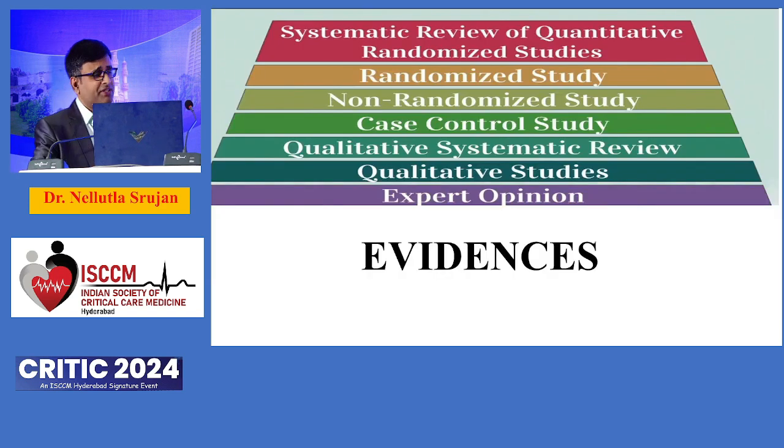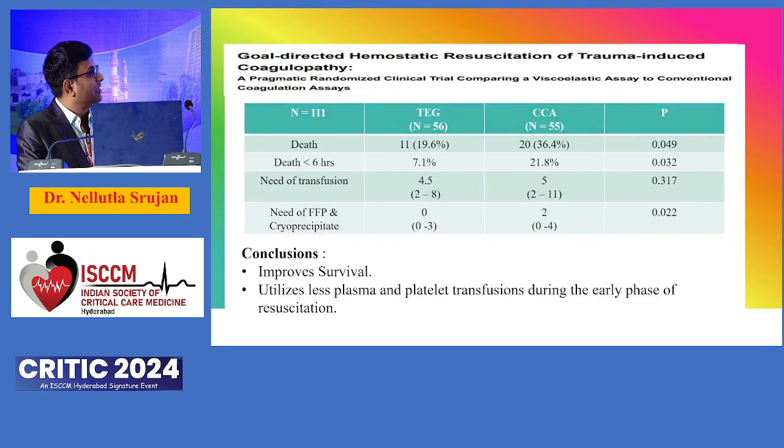We'll talk about evidence, how many studies were done for this requirement of TEG in your ICUs.